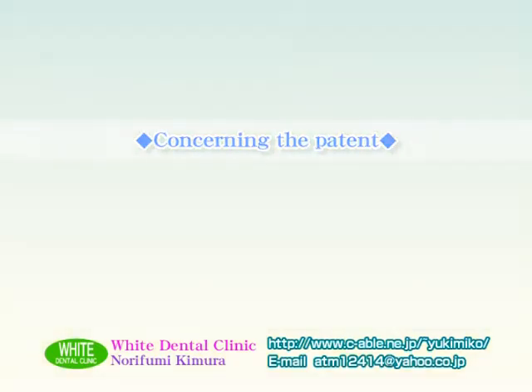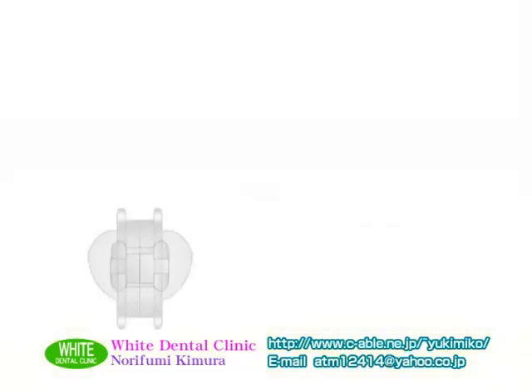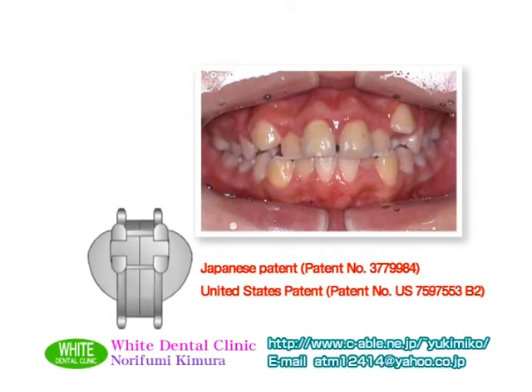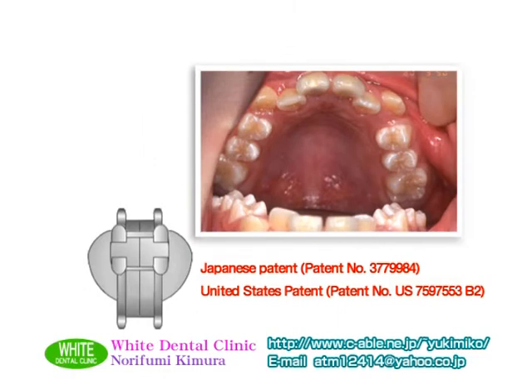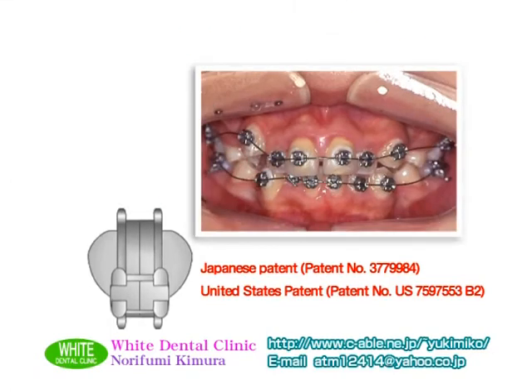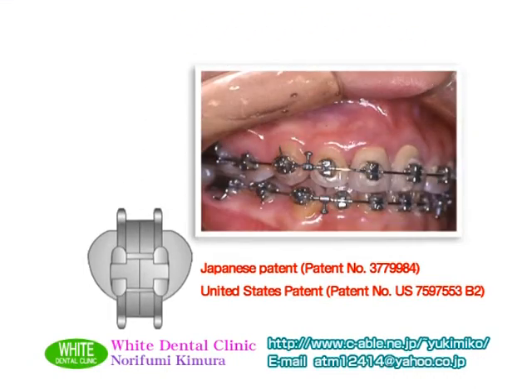Concerning the patent, the slide type bracket has already acquired a Japanese patent and a United States patent. Under normal circumstances, I have to report the experimental results clinically or in a typodont using a prototype model of the slide type bracket. Since significant expenditures are required to produce the prototype, I have not yet started on one.